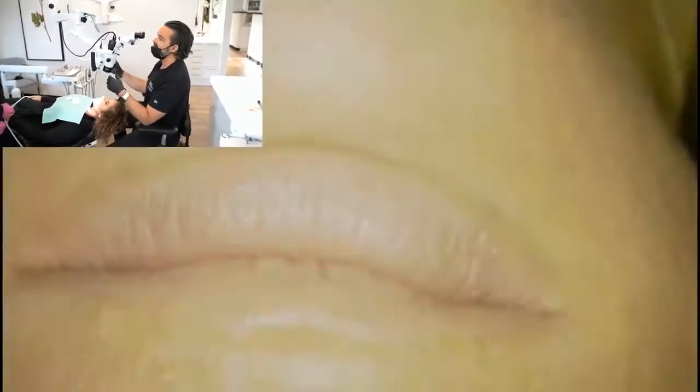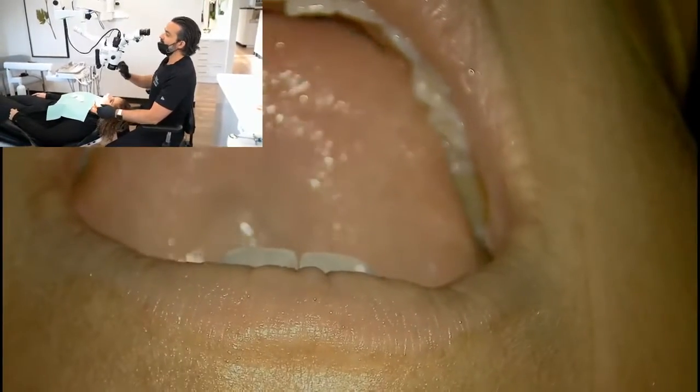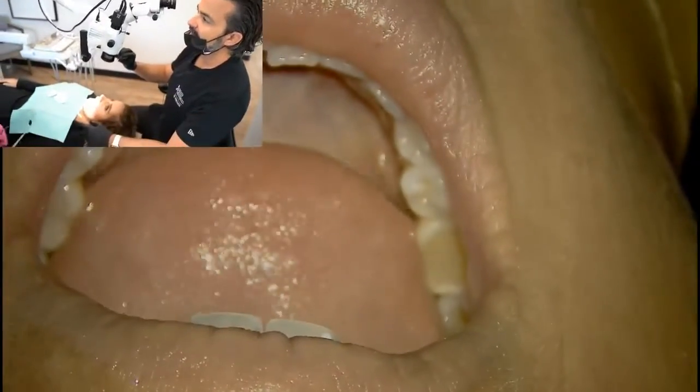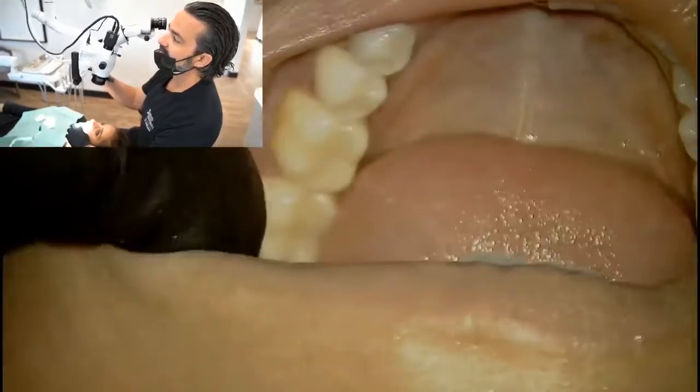Alex said, could you explain how you place the patient's head depending on the arch you're working on? One of the things that I'm stressing is that in the 12 o'clock position, the arch actually does not matter. So Lindsay, you want to open? And when I'm looking at the lower arch, I have good direct vision. The lower arch is very easy to see.